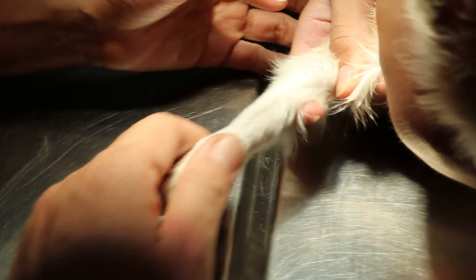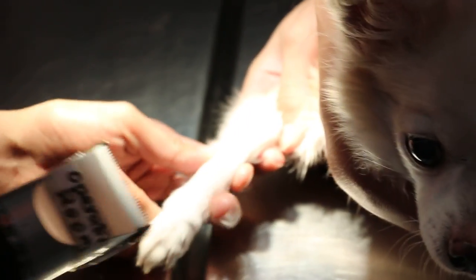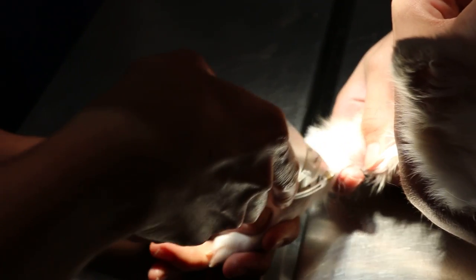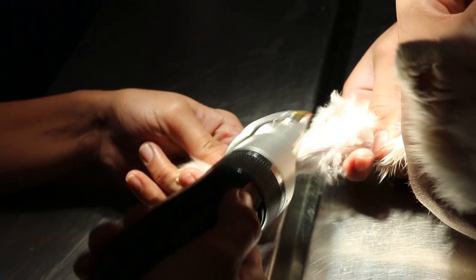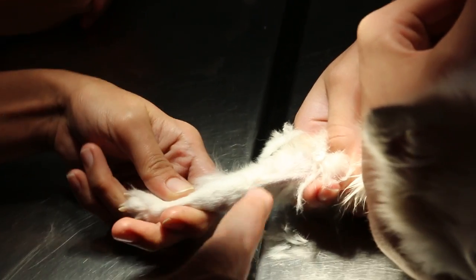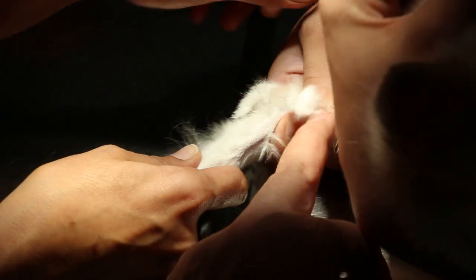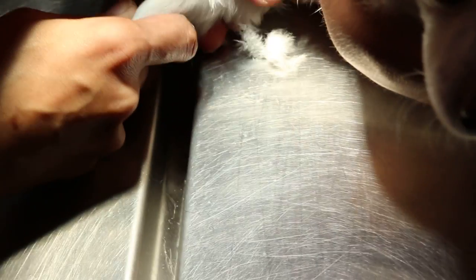Twist a bit more — your thumb. Always close to the body, and that one close. So we shave a bit so that you can see the vein. Talk to the dog. You can see the vein is very obvious — you'll never find such a nice vein. So you press here and the vein will distend. You understand? Use your thumb to do this, not this. Your thumb comes over here — go down below and come out. Good.